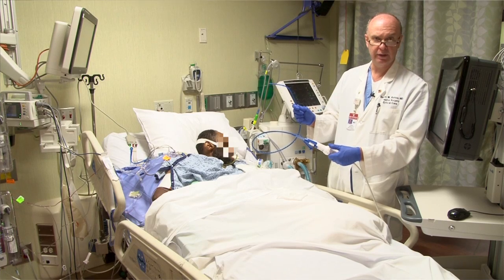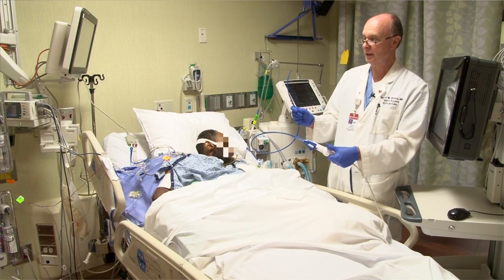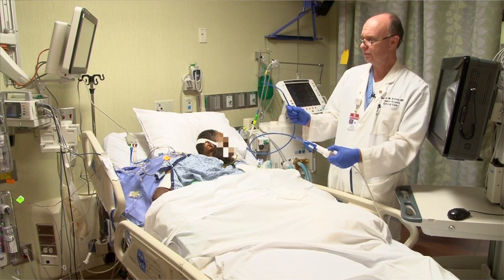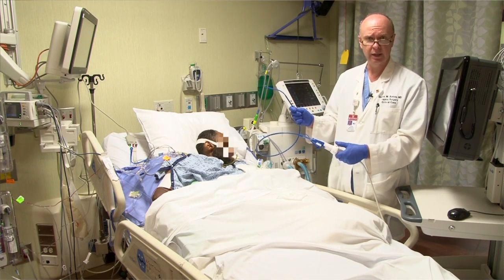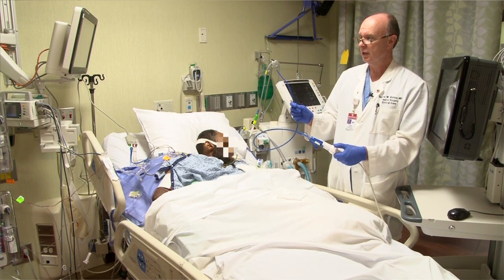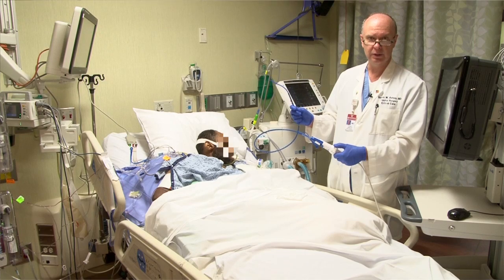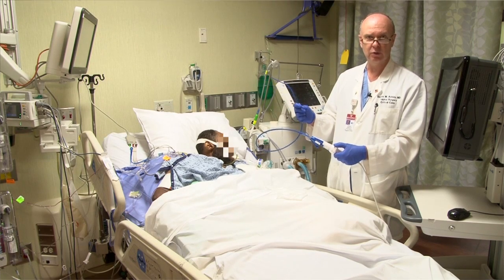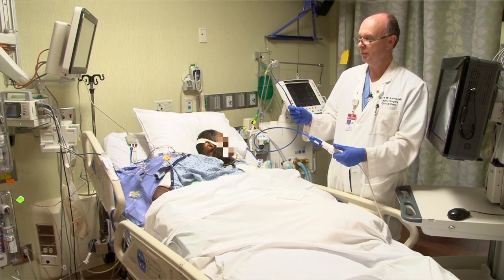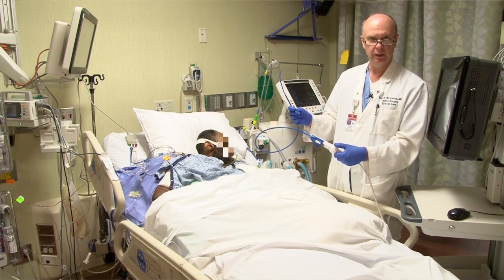Now you see how much variability there is in the probe. I have a great degree of ability to move that probe, but in an actual patient setting, once it's in the esophagus and in the stomach, I really only need small movements. A small movement can make a big difference when I'm trying to look at the leaflets or the ventricle. We really don't need all of this movement, but we have the ability to do that if we need to.